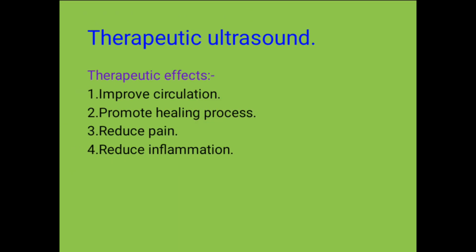So what are the therapeutic effects? Therapeutic effects of ultrasound include improved circulation, which we have already mentioned. You are well capacitated with that. The healing process will be stimulated, or will occur more effectively. This is through increased blood supply to the point of injury, and equally stimulation of the cellular activity around that point, so the rate of healing will be increased.